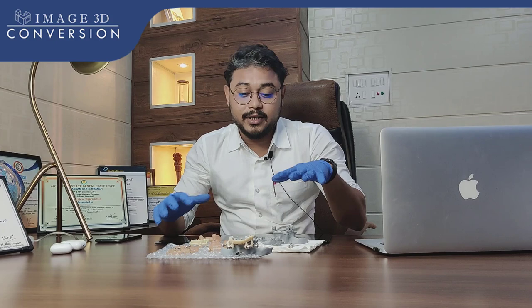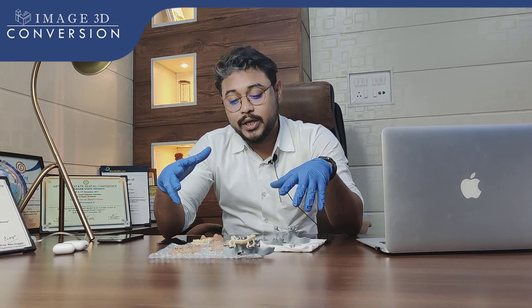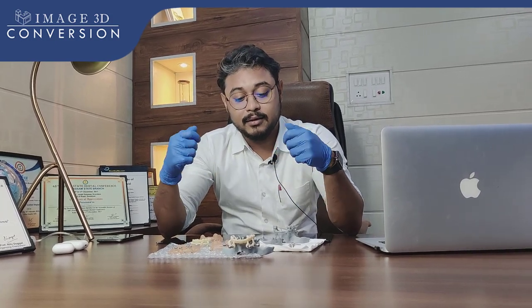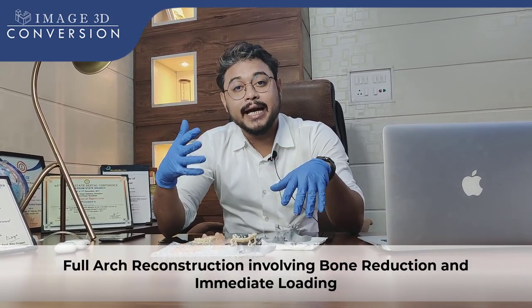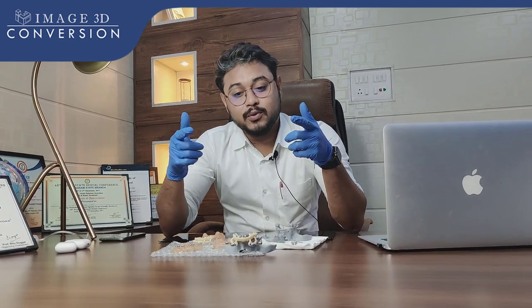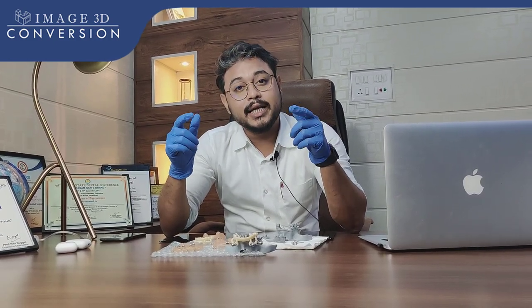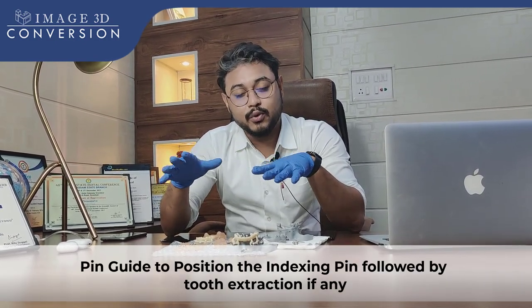We have 3D printed all the models and surgical guides. This is going to involve bone reductions, delivering implants, and we have prepared one surgical guide for implant placement.